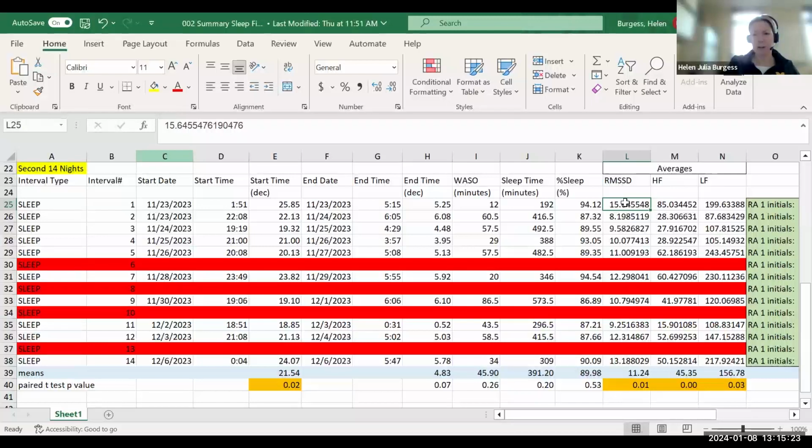And Kathy mentions in her paper that out of these metrics, the root mean squared successive difference is probably the one that you would want to use because I think it has fewer assumptions associated with it. The spectral analysis methods, I think there's a lot of stationary data assumptions that go into that. So the root mean squared successive difference is probably the best one. I'm not sure, honestly, we're going to extract this for every sleep study. It's also pretty involved to pull all of these out into a summary variable, but possible.